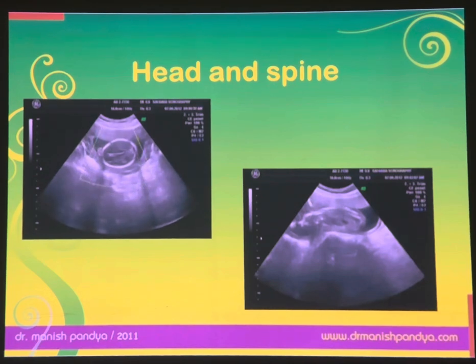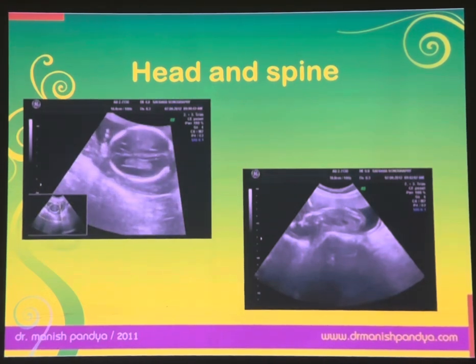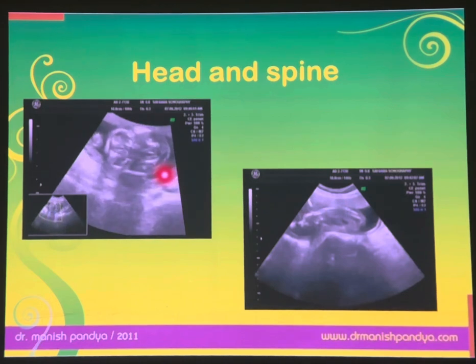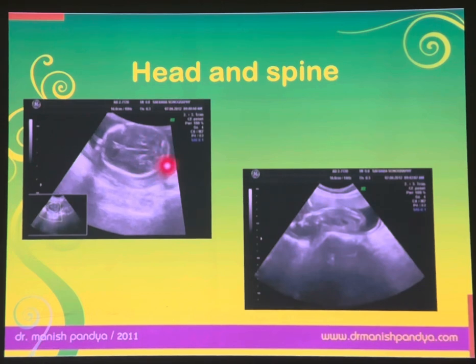It is not difficult at all to measure all this. Always try to zoom the patient. Now you can see there is very good fluid. This is a ventricular plane. This is a thalamic plane. And just go below the thalamus, you are able to see a beautiful cerebellum. Okay? Below the thalamus, there is the cerebellum, because the thalamus and cerebellum both are lying in the occipital region.